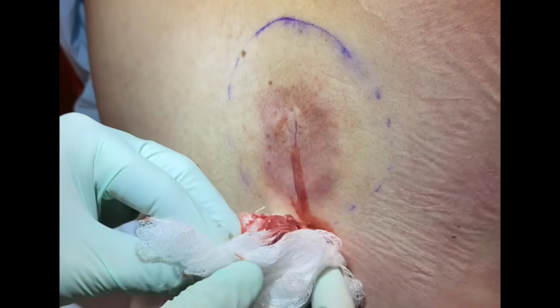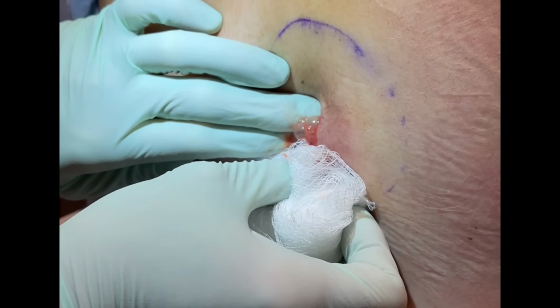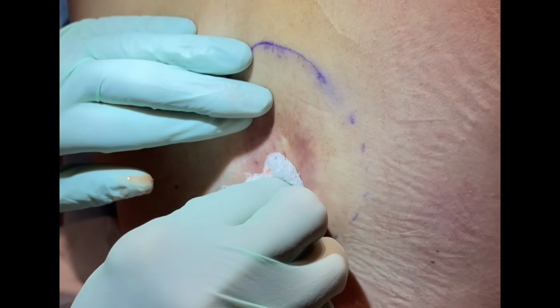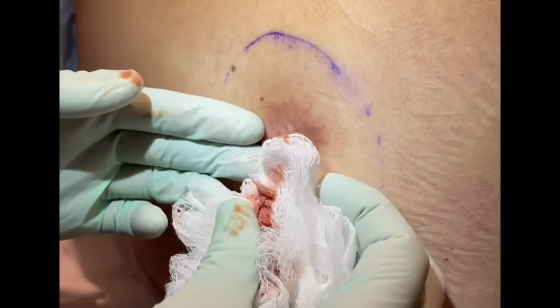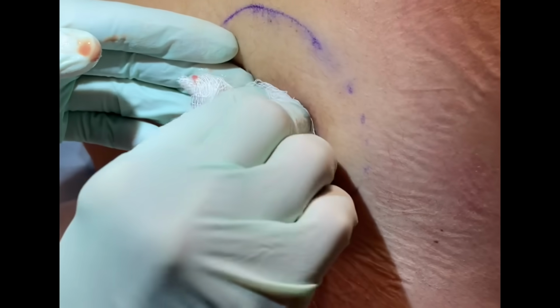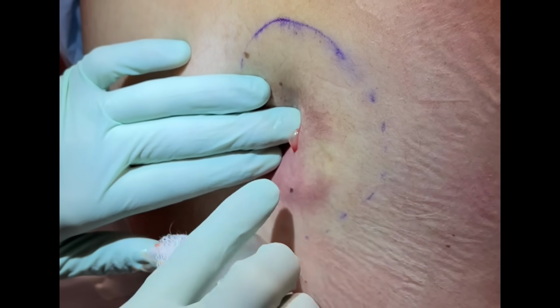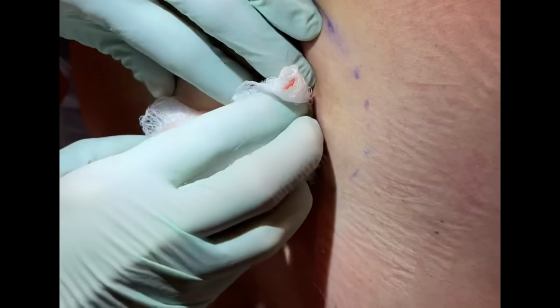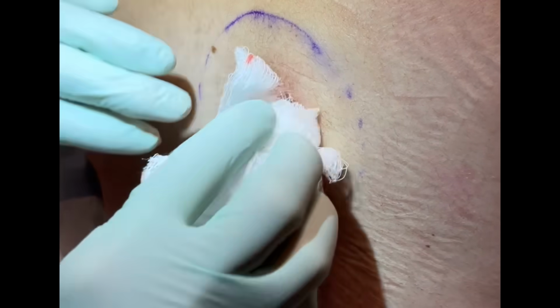I still haven't seen a whole lot of cyst particles here. So if it was a cyst, it possibly wasn't that big. But now when we put a pressure bandage on, it's going to push down on the pocket. That'll be good. There's not much left in there. Come from the bottom and the top here. It's quite a spot there, though. It's quite an indentation you can see.